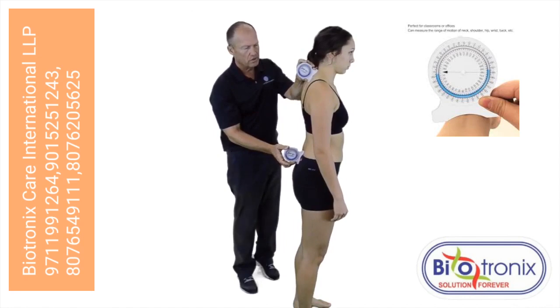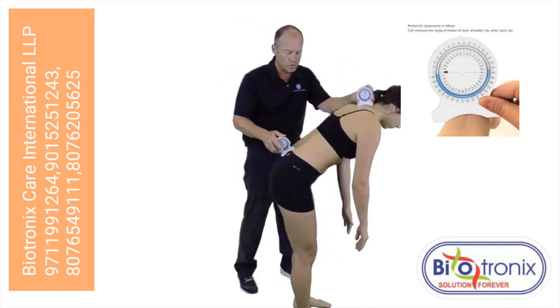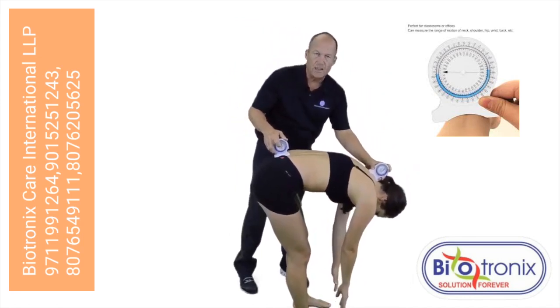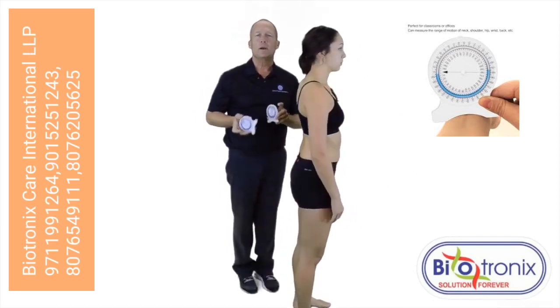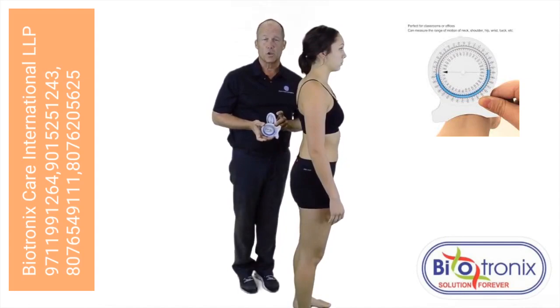In this position, I'll have the patient flex forward, maintaining the inclinometers on their landmarks. Both would give me an angulation measurement, which I would record. The patient can stand back up, and I would take the difference between the two measurements, and that would give me an indication of the degree of thoracolumbar flexion.